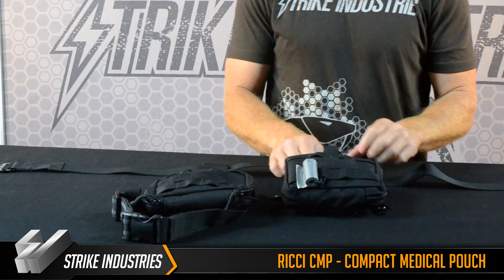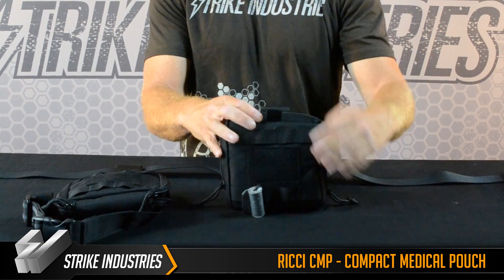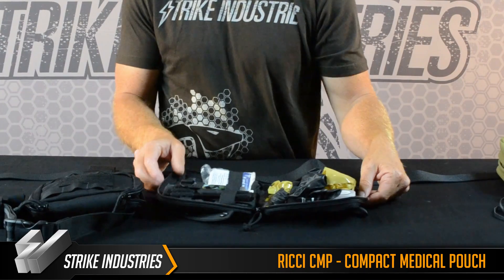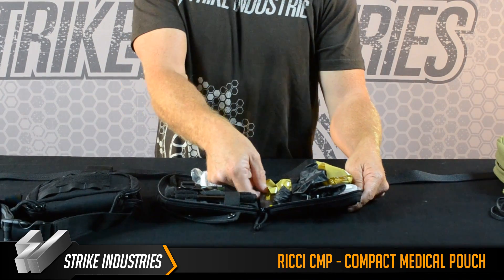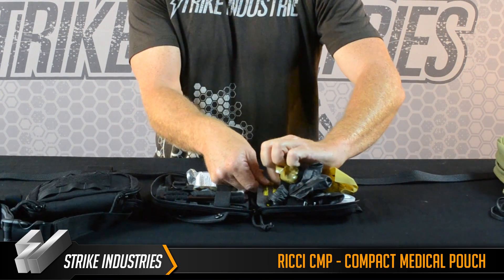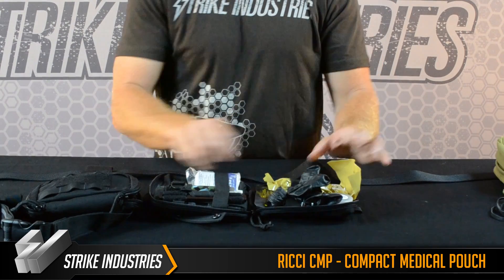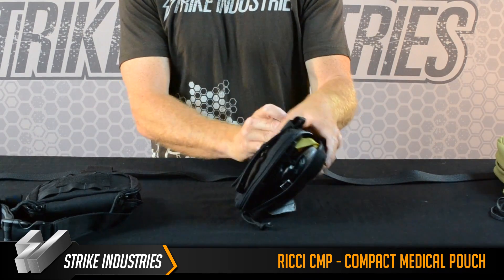The compact medical pouch has MOLLE on the back and opens up like a standard pouch. In there you've got elastic that allows you to hold your tourniquets, your gauze, your quick clot, any of the items that you need. It's also got this interior pouch that allows you to put in your chest seals and any other flat items that you have.